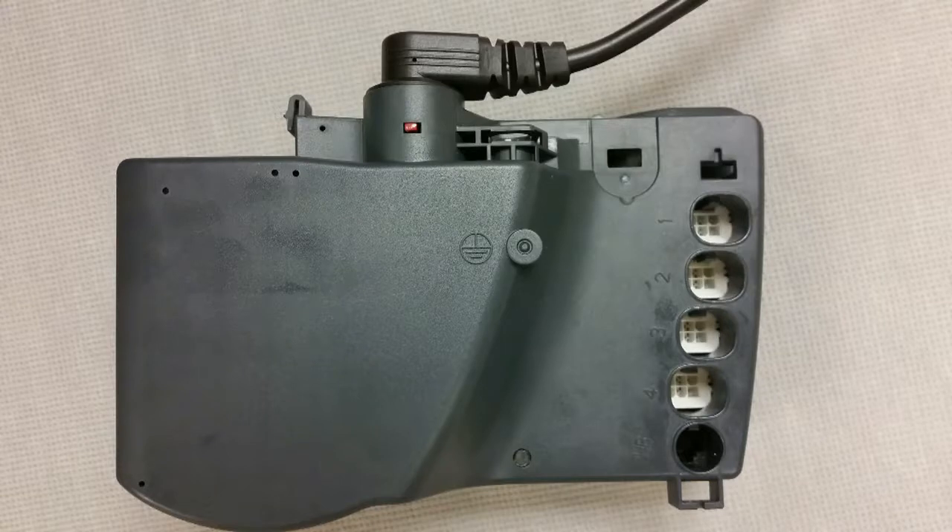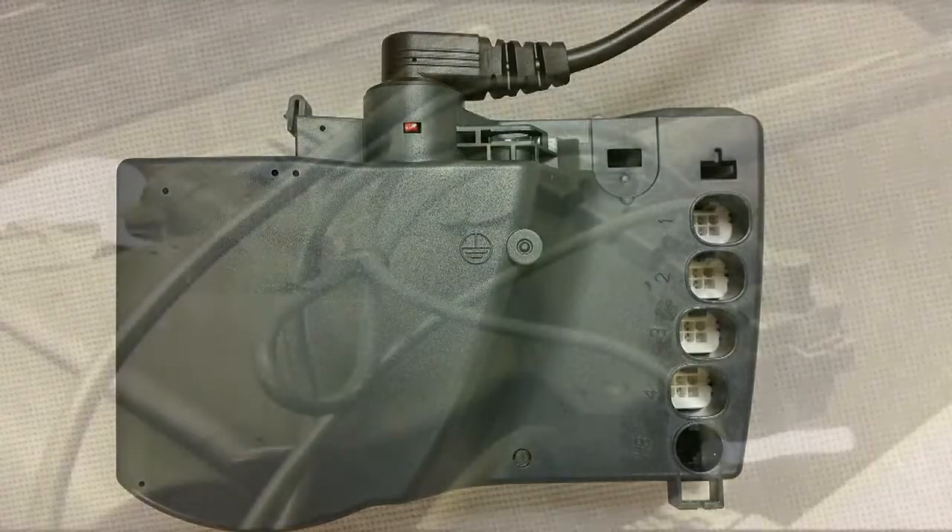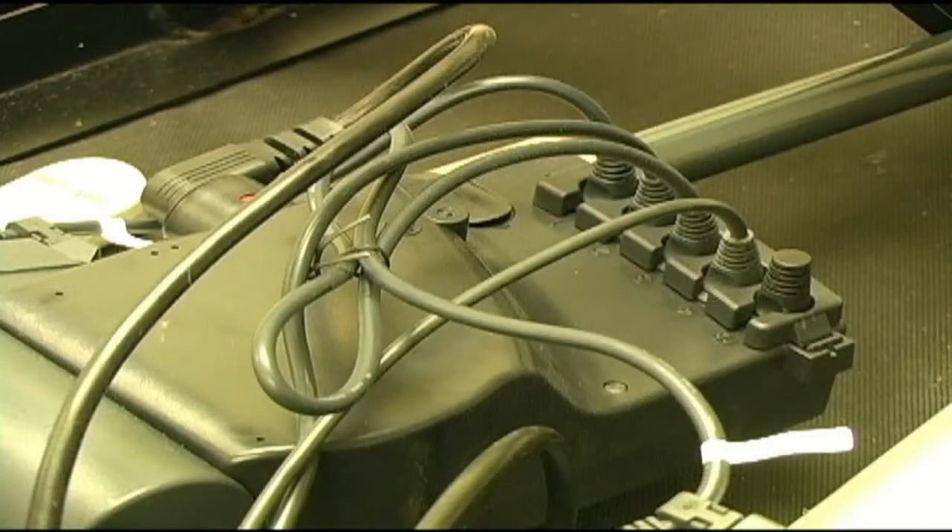There are five ports on each control box. Each port does not necessarily have a wire plugged into it. Depending on your bed's configuration, it may have as little as two ports with wires plugged in, or all five ports may have wires plugged in. The easiest way to find your control box is to follow the wires. All wires from the motors lead back to your control box as seen here.